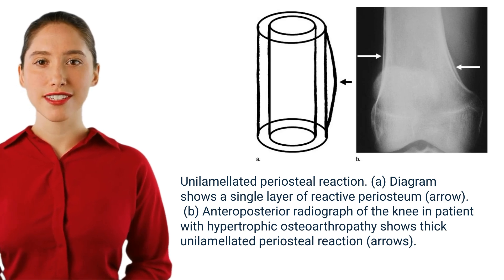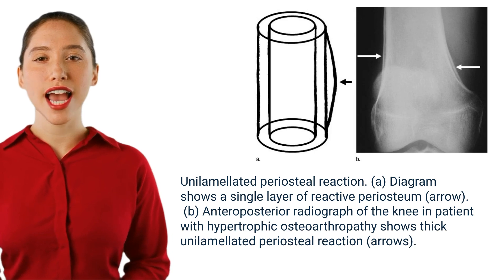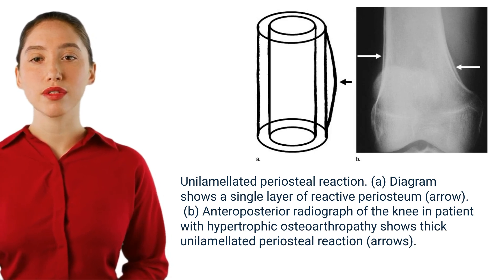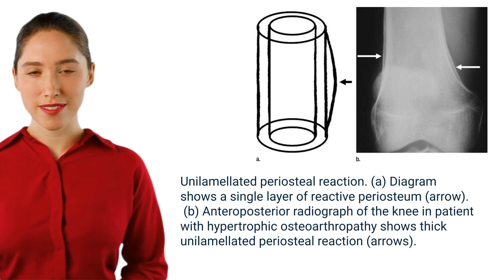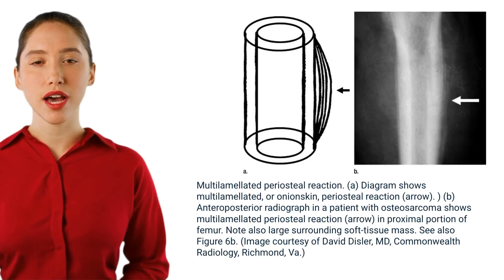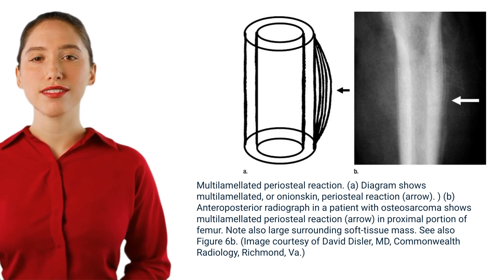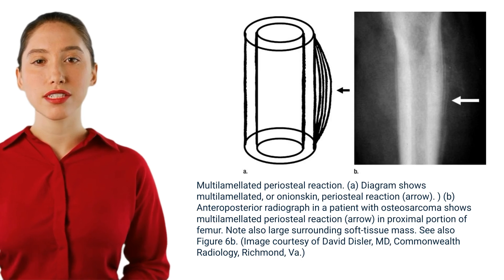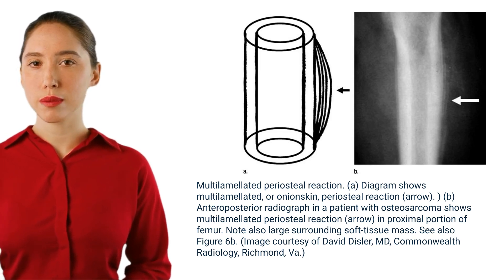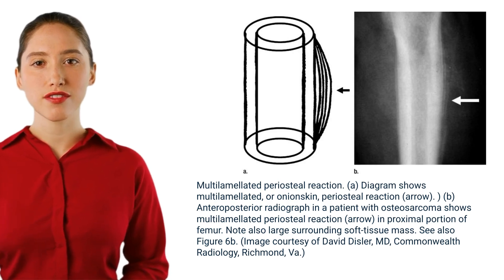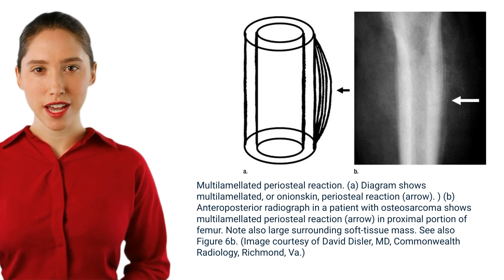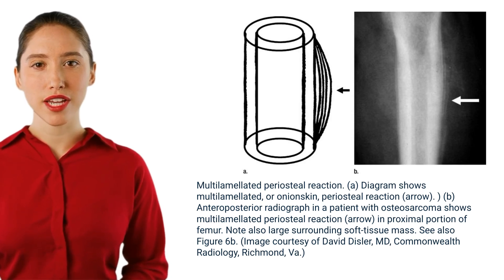Unilaminar periosteal reaction: diagram shows a single layer of reactive periosteum. Anteroposterior radiograph of the knee in a patient with hypertrophic osteoarthropathy shows thick unilaminar periosteal reaction (arrows). Anteroposterior radiograph in a patient with osteosarcoma shows multilaminar periosteal reaction (arrow) in the proximal femur with a large surrounding soft tissue mass. Image courtesy of David Disler, MD, Commonwealth Radiology, Richmond, VA.